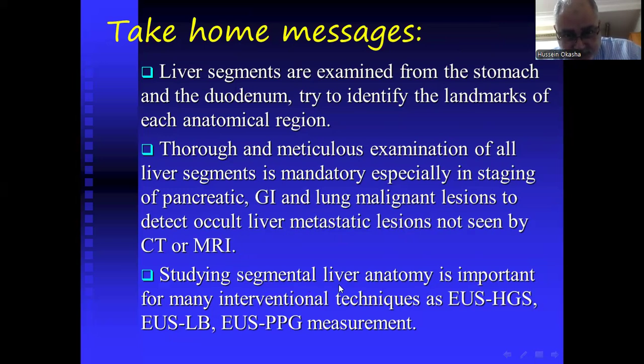And studying segmental liver anatomy is important for many interventional techniques such as EUS-guided hepatogastrostomy, EUS-guided liver biopsy, and EUS-guided portal pressure gradient measurements.